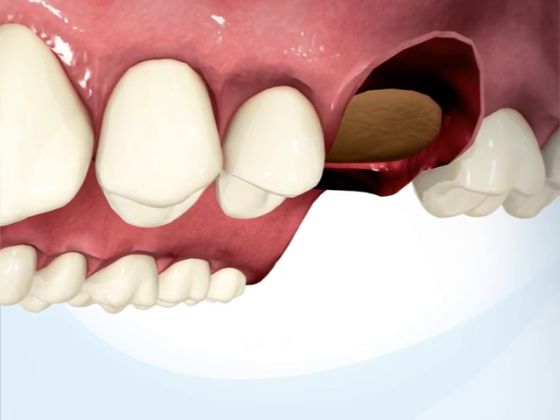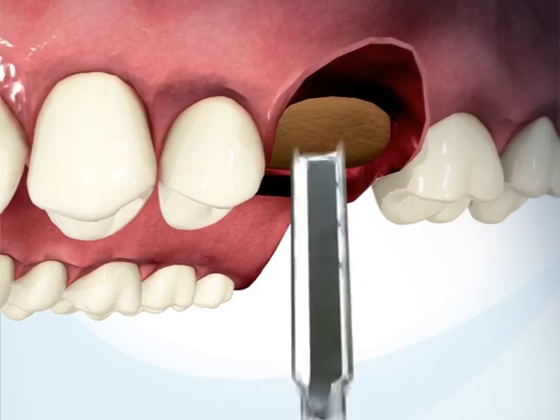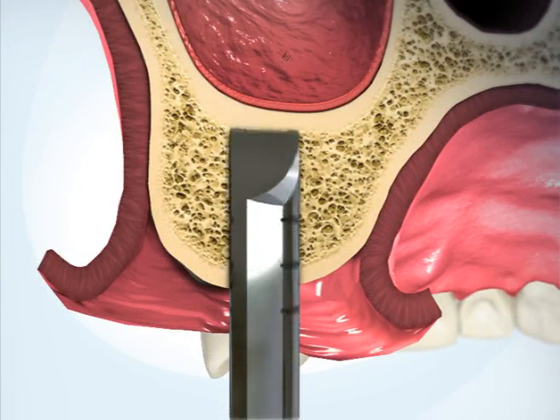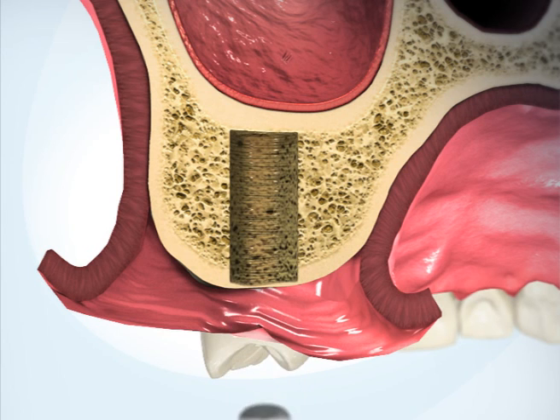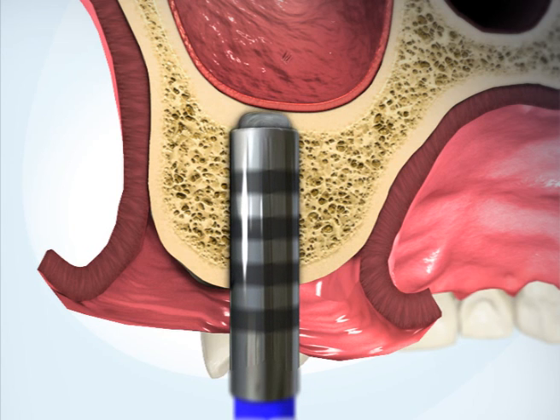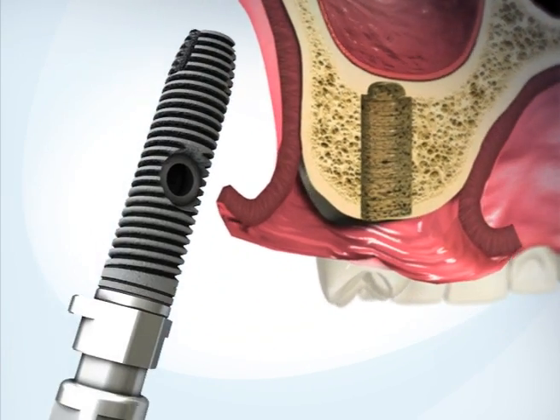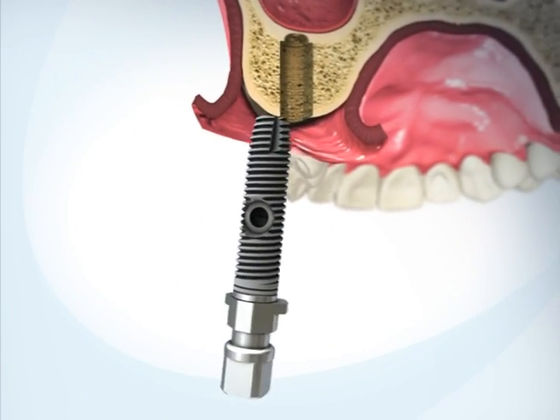Begin the procedure by drilling an osteotomy at the implantation site. Use the flat drill to stop drilling at the hard bone of the sinus cortex. Use the special cortex drill to weaken the cortex. Insert the implant until the end of the osteotomy.